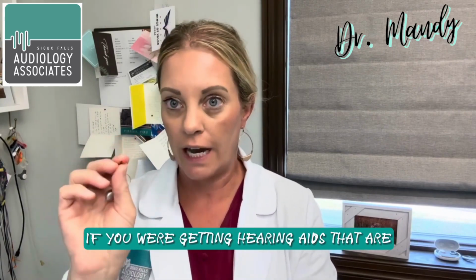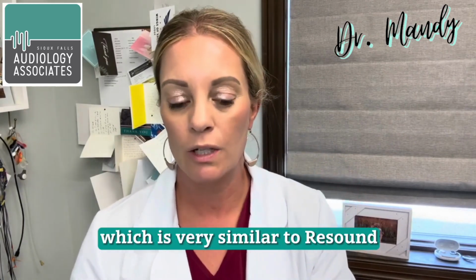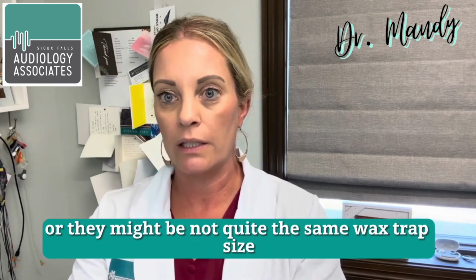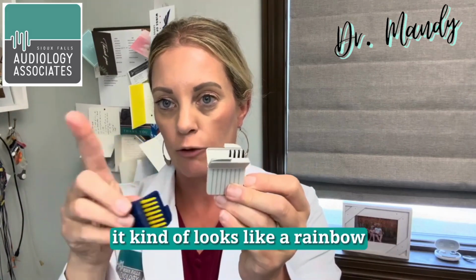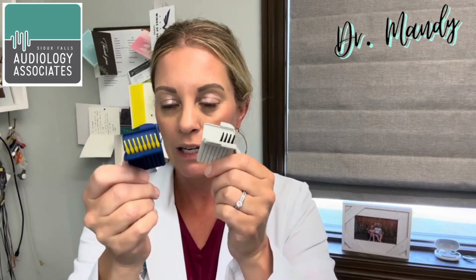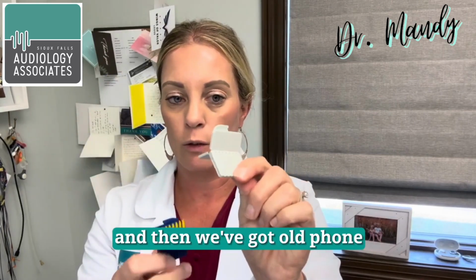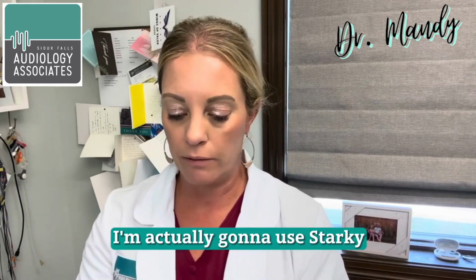If you have hearing aids that are older than that, you're probably looking at something like this, which is very similar to Resound, Starkey, Signia. They all have a similar setup. They just might be different colors, or they might be not quite the same wax trap size. So this is kind of what you're looking at. And Oticon has something very similar. It kind of looks like a rainbow, but it still has the same wax trap to replace. So these sticks in Oticons, I'm going to show you how to replace these. These are going to be your other manufacturers. Blue is Starkey right now, and then we've got the old Phonak, Resound, newer Resound will have a gray or a white package. So I'm actually going to use Starkey because that's what I'm wearing.